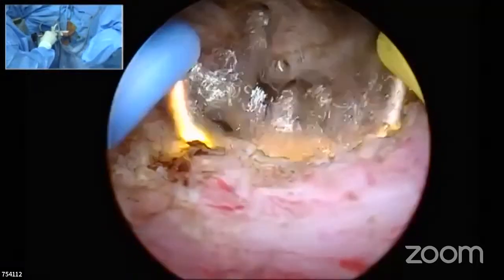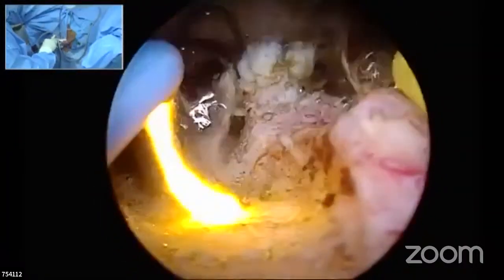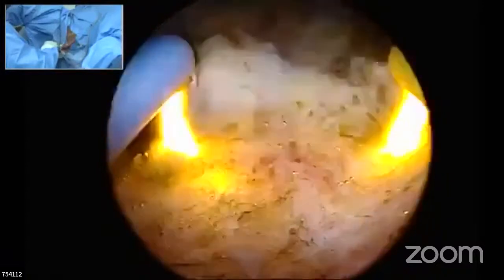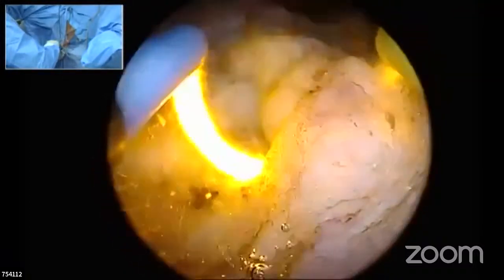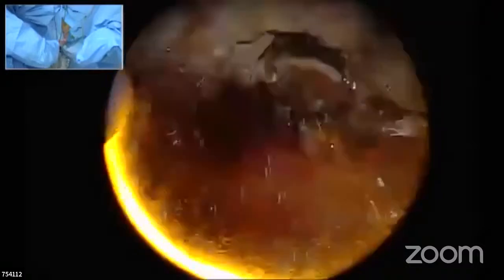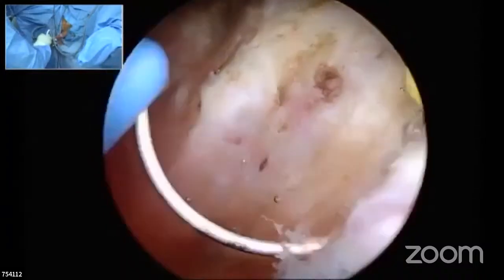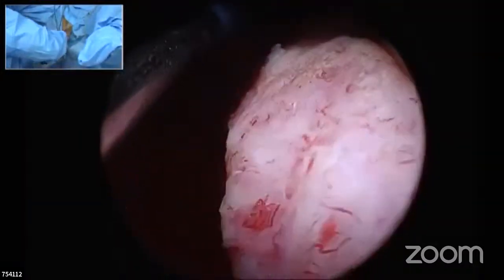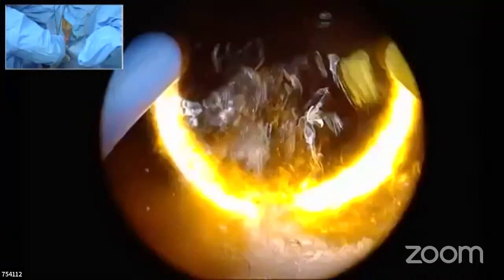Yes, sir. Logically, all these things, sir. I would say absence of mucosa in the bladder neck. Number two, a small bladder neck, which ends up as a smaller gland that contracts and causes bladder neck contracture. If there is a subtrigonal extravasation of fluid, you have made an opening into the bladder neck area, and that can cause a contracture. Anything which causes more fibrosis, such as excessive use of coagulation, can cause bladder neck contracture. But at the same time, people who had all this never had a bladder neck contracture, and people who had nothing had one. So we are not sure what exactly is the reason, but we take all our measures to prevent it, as all these points have been raised as logical reasons for bladder neck contracture in these patients.